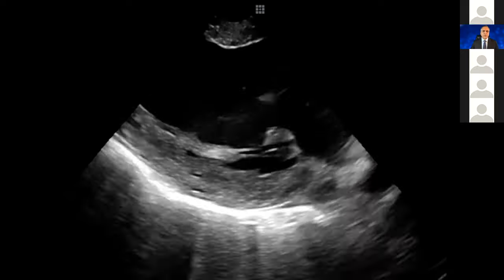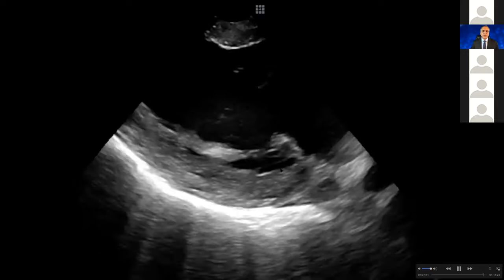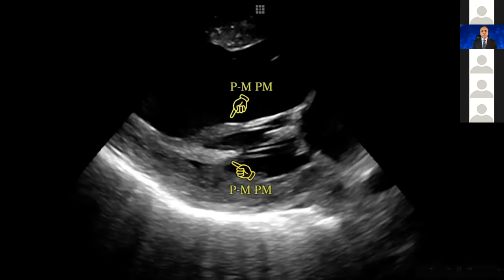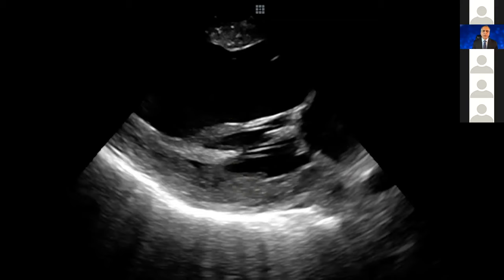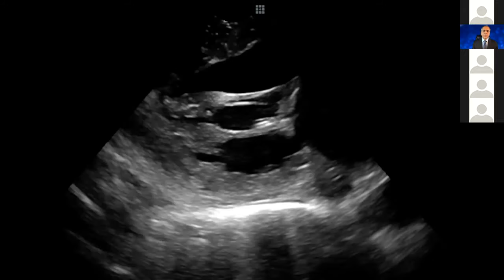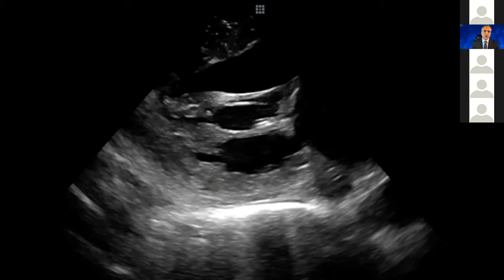Here you can see another case — interestingly, this patient has two posterior medial papillary muscle heads, so this is one and the other one. If I go down and clock my eyes, there are going to be two more papillary muscle heads, which are the heads of the anterolateral papillary muscle. So if I ask you to show me on a kind of Google map where this PVC could be coming from, it could be coming from any of these spots.